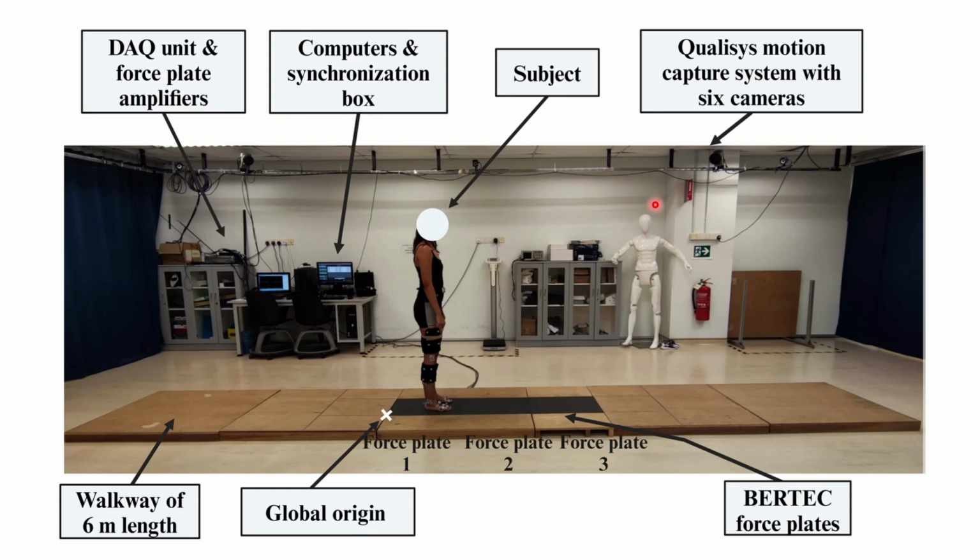As an example, in our study, we analyzed the lower limb and we looked at the subject just moving or walking up and down. So we actually wanted a large capture volume. And that's why the cameras are ceiling mounted and sort of angled or targeted towards this region surrounding the 3 force plates, which is our capture volume. On the other hand, if you were analyzing things like finger motion, you could actually bring these cameras down, mount them on tripods, and then focus them into the region that you want to capture, and only that region.